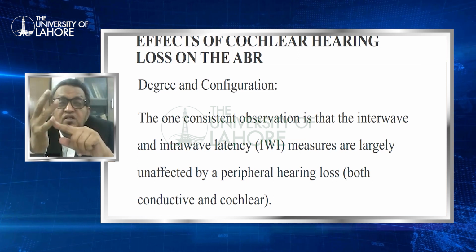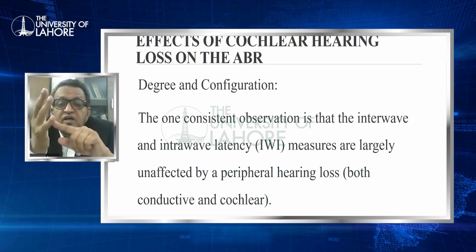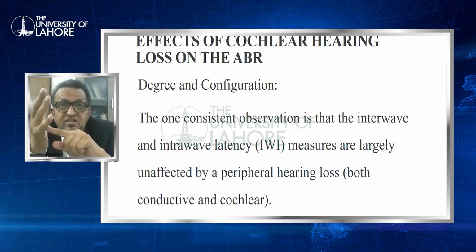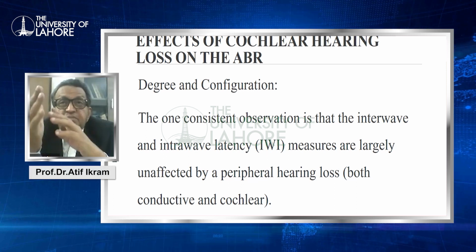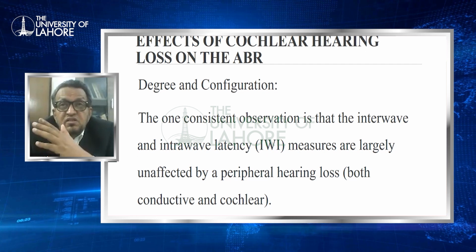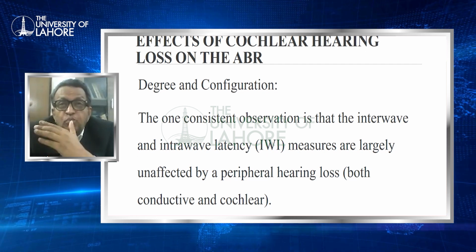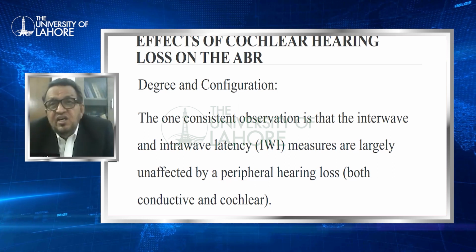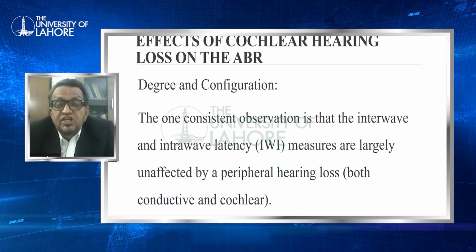There are normal latencies at certain intensities, available as norms for that age group and that intensity. The latencies are measured.